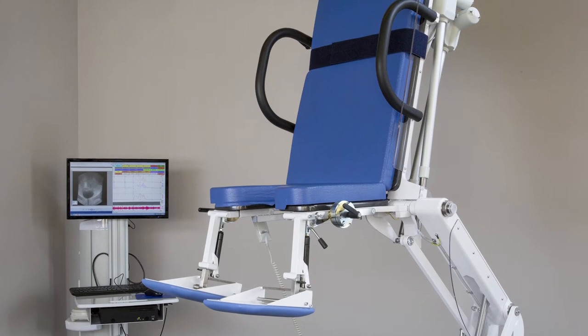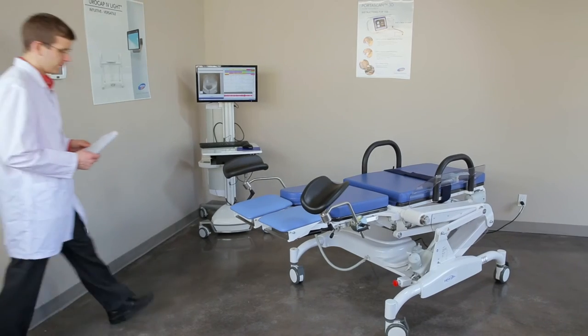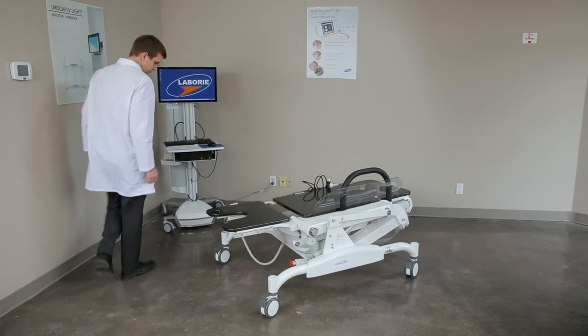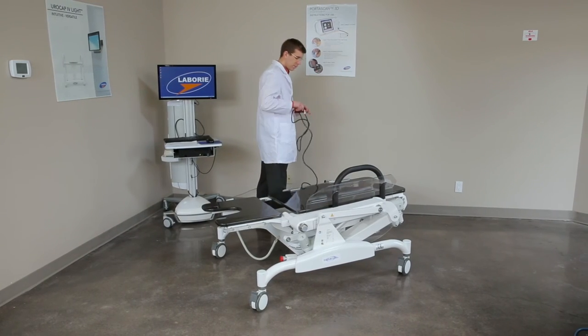The table is designed to support up to 250 kg or 550 pounds, but it is not designed to support someone sitting on the very end and may tip or otherwise be unsafe. Please ensure that the brakes are used whenever a patient is using the table or at any time it is not being moved to a new location.